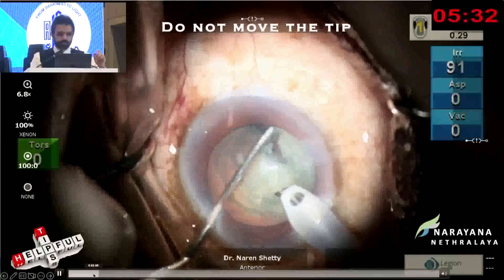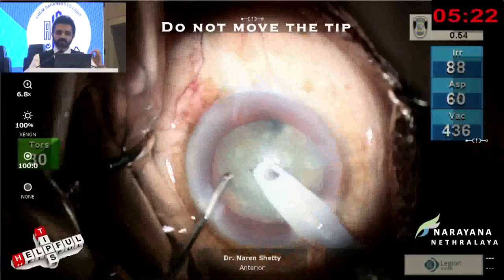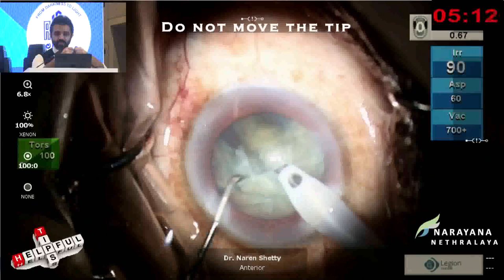Yeah. So you can see here, I'm just placing in front of the tip, towards the tip, sideways. Front of the tip, towards the tip and then sideways. Just a very simple way. It is something like holding a paper. If you hold the paper too far apart and try to tear it, it is not possible. If you hold the paper next to, keep both your fingers next to each other and then tear the paper, it tears immediately. So it's very, very important.